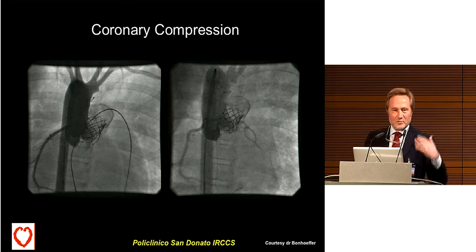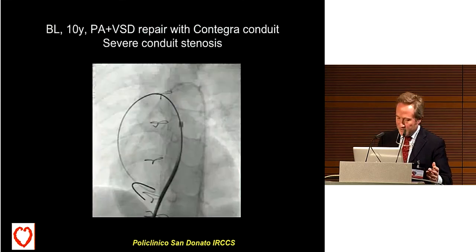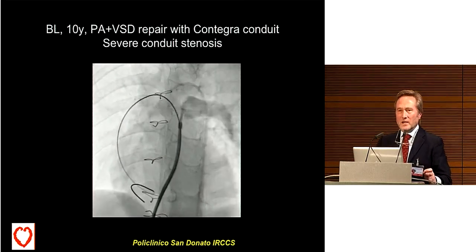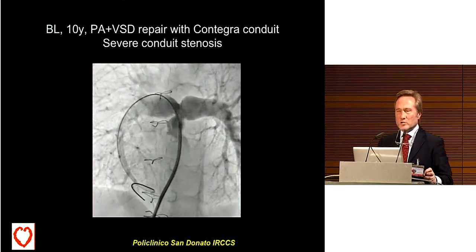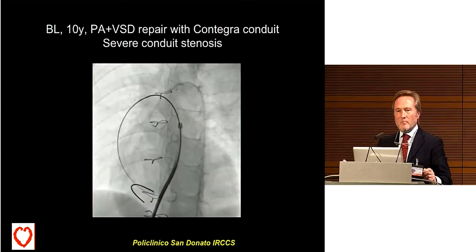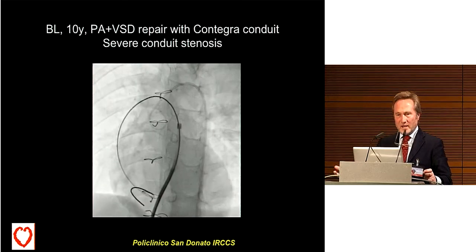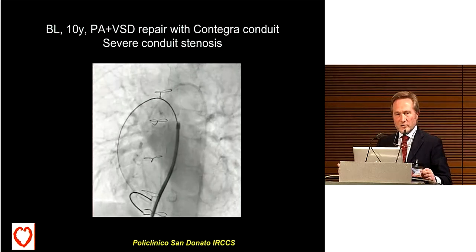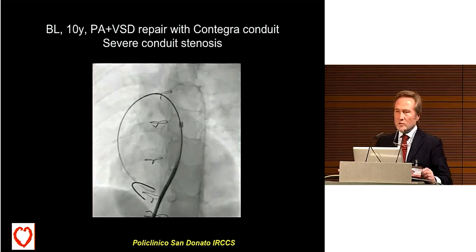Of course, we have to avoid this complication, and that's why it has been introduced routinely, I would say, in clinical practice to do a balloon inflation test with simultaneous aortogram or coronary angiogram to rule out the possibility of coronary compression.